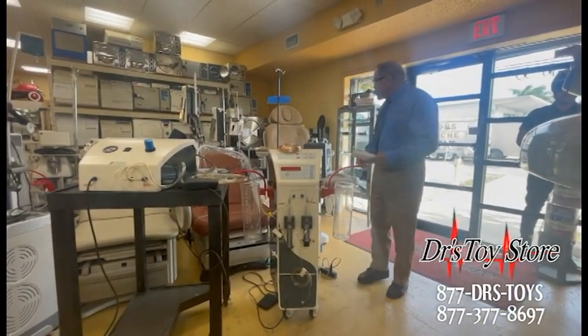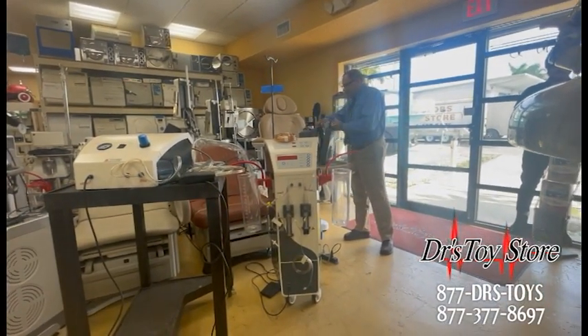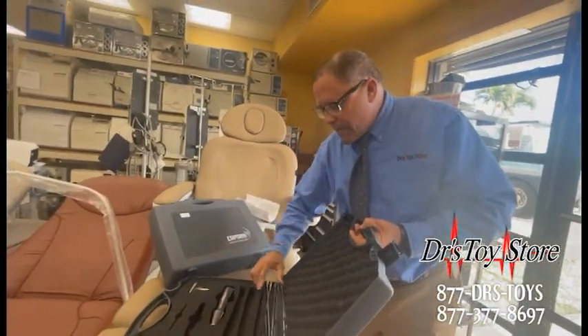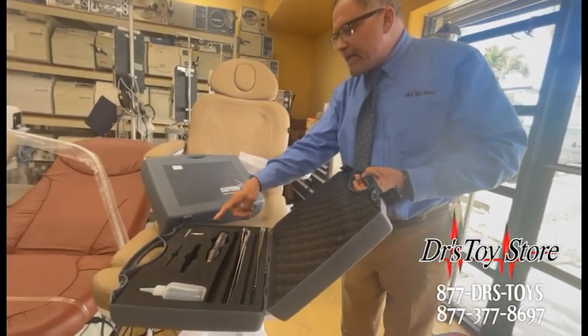We have them at the Doctor's Toy Store — these just came in. These are Uromi. We have the threes, which are very popular, but this one over here is the Uromi 4, and it comes with a really nice handpiece plus the cannulas — everything with it. We go over how to maintain it and clean it.